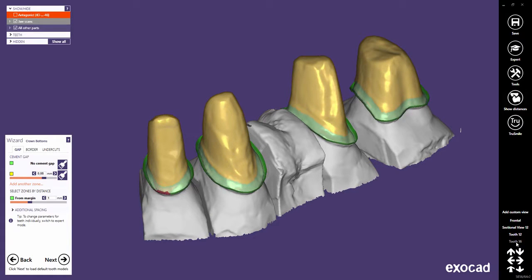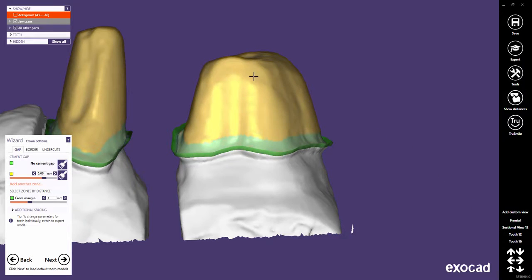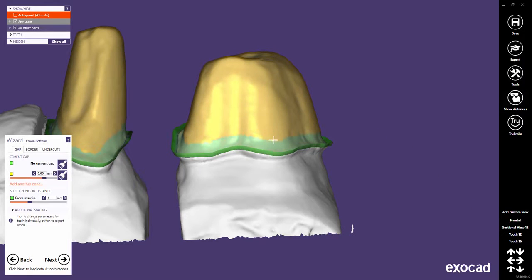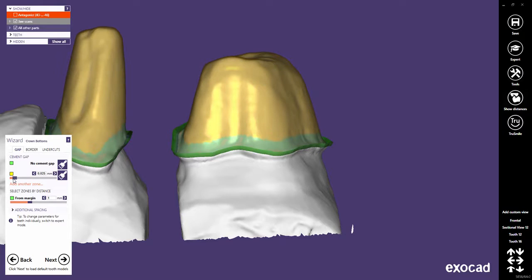Let's choose a custom view for tooth 16 to show the main cement gap parameters. The yellow area is the cement gap zone. It can be adjusted with the cement gap slider. And as you can see now, the new cement gap is computed in real time.